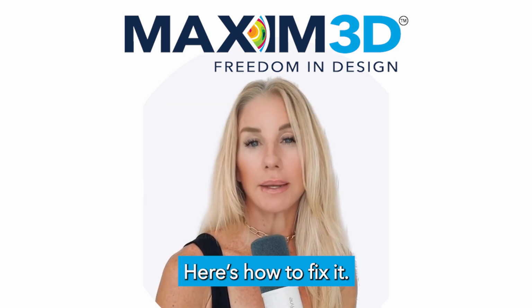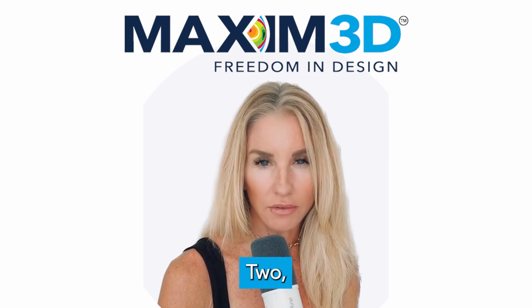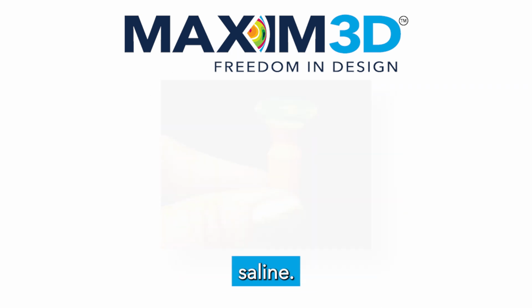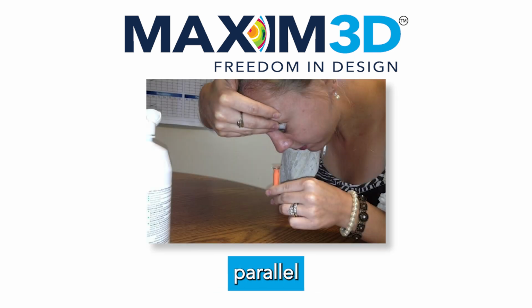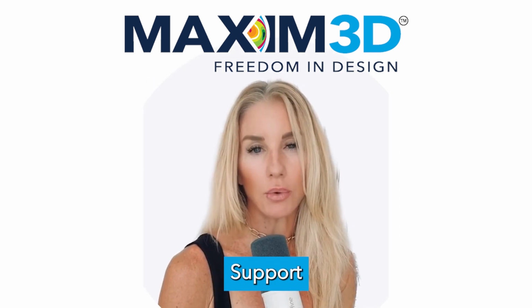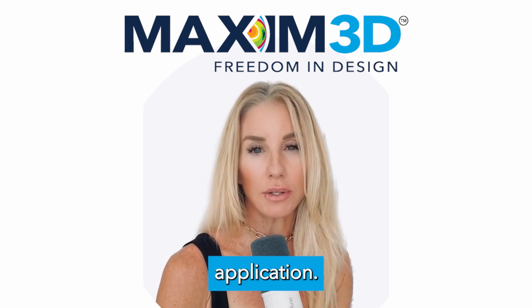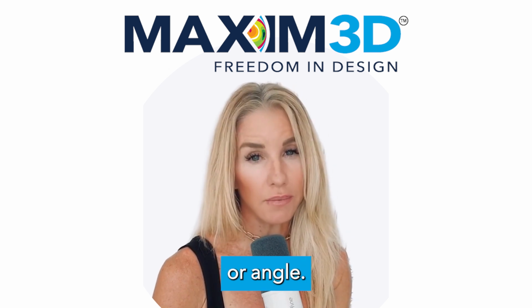Here is how to fix it. Number 1, re-educate the patient on insertion technique. 2, fill the lens bowl completely with non-preserved saline. Eliminate all air pockets and instruct the patient to keep their head parallel to the floor when applying the lens. Use tripod hand support, 2 fingers and a plunger, to stabilize lens application. Emphasize lens alignment, with no tilt or angle.